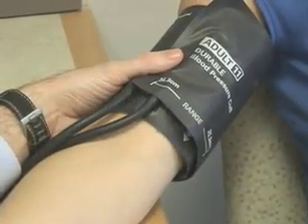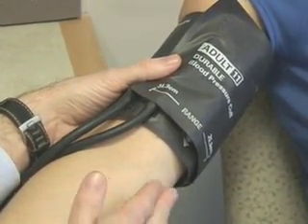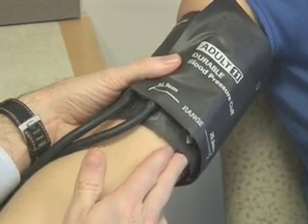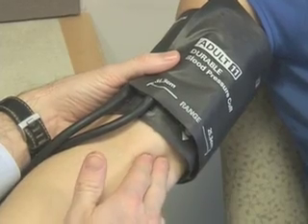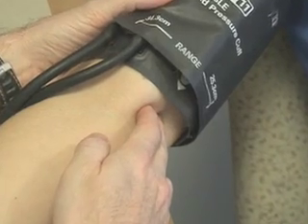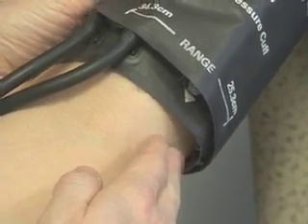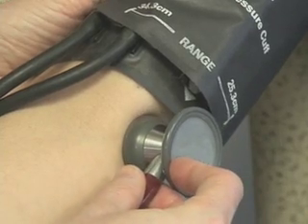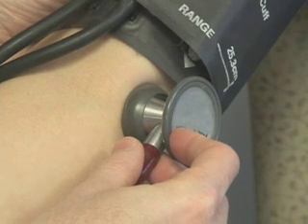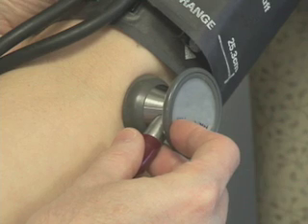The cuff should be applied two centimeters above the crease of the elbow. It should fit snugly but still allow two finger widths under the cuff. Next, find the brachial artery, which is palpable approximately four to five centimeters from the medial epicondyle on the anterior surface of the elbow. Place the stethoscope lightly against the skin over the brachial artery. There should be appropriate pressure to ensure good sound transmission. The stethoscope should not be in contact with clothing or with the cuff.